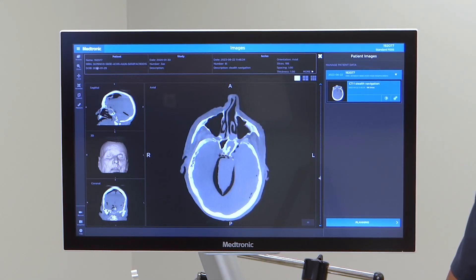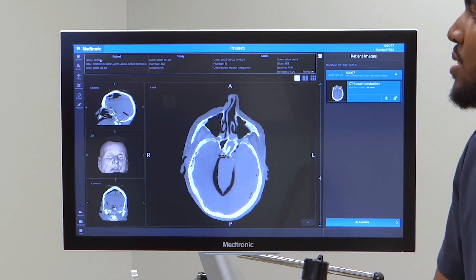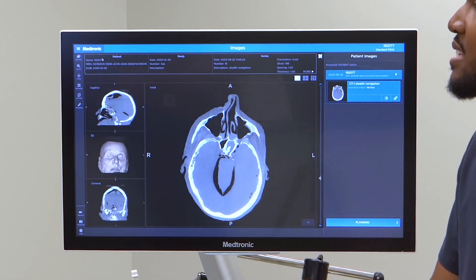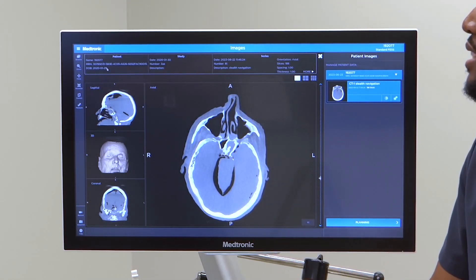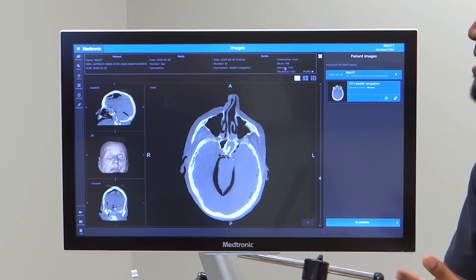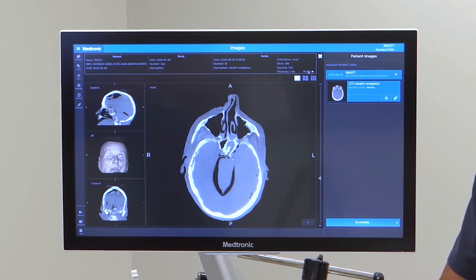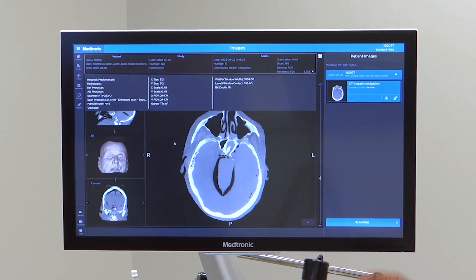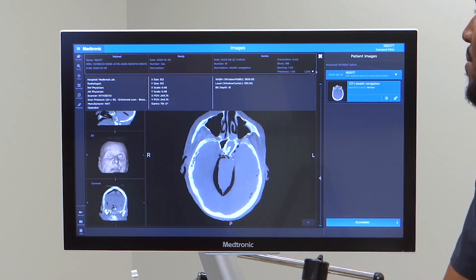At the top of the page, you can also see the patient's name or how the scan is labeled, their date of birth, as well as the slice spacing and thickness. You can get a little bit more information about the scan when you press more.